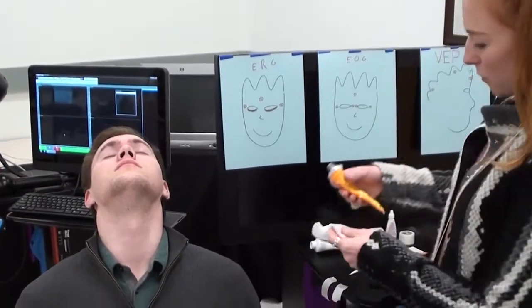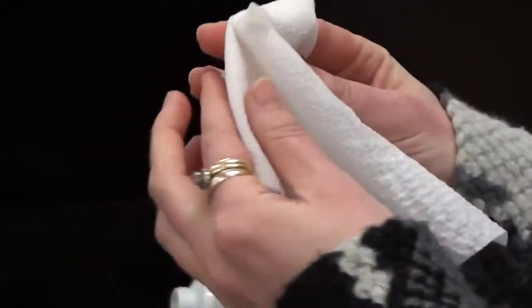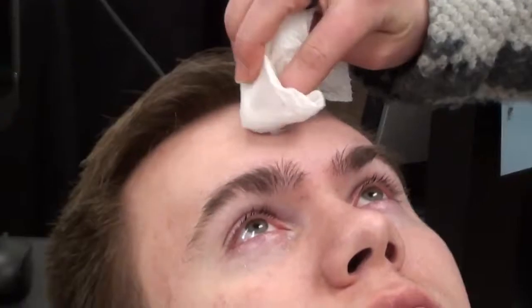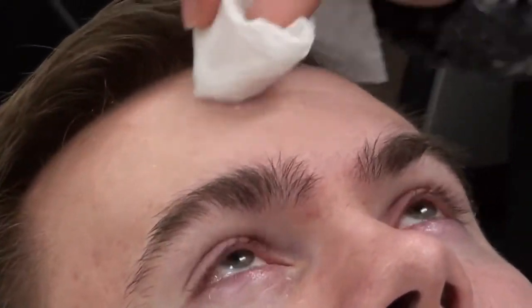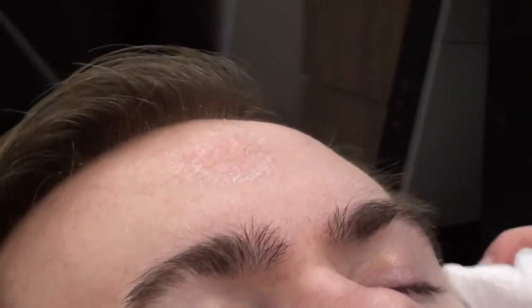In the meantime, we can take our lemon prep and start to clean the area. I'm going to clean Ryan's forehead and next to his eye in smooth circular motions to remove any oils, dirt, or makeup from the skin.